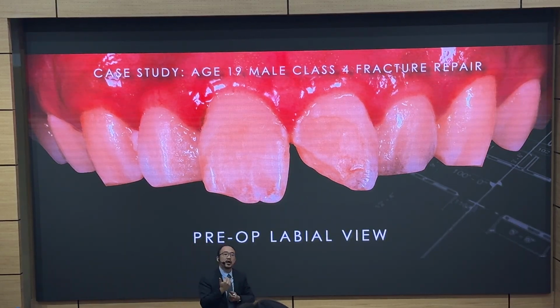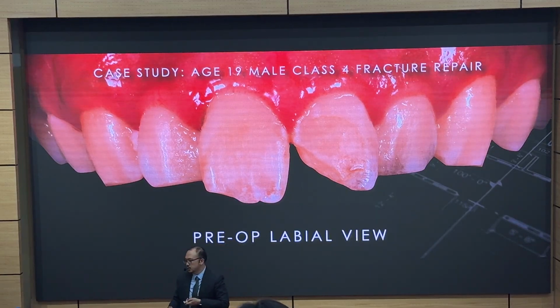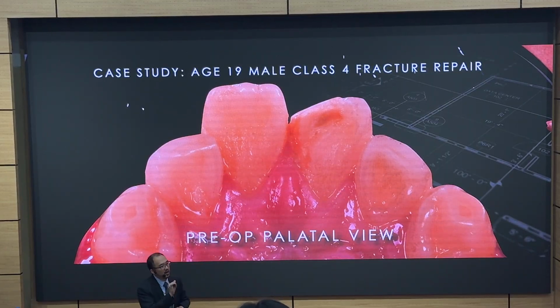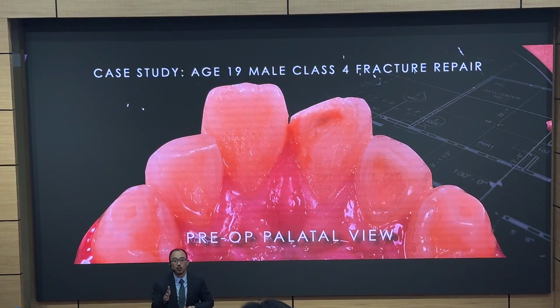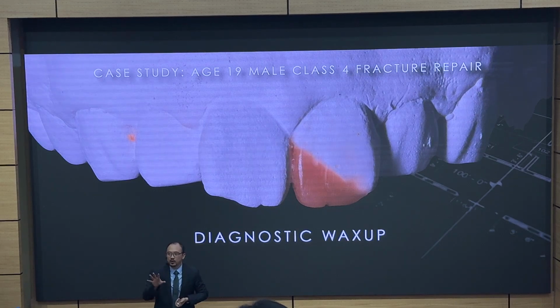B, it's going to be quite hard for me to control the layers that I'm supposed to put in. Especially for this case where if you look at it, his teeth are quite reclined. So the positioning is very hard to control. So what I did for this case is I took an impression and I did a wax up. Now, I know what you're thinking.